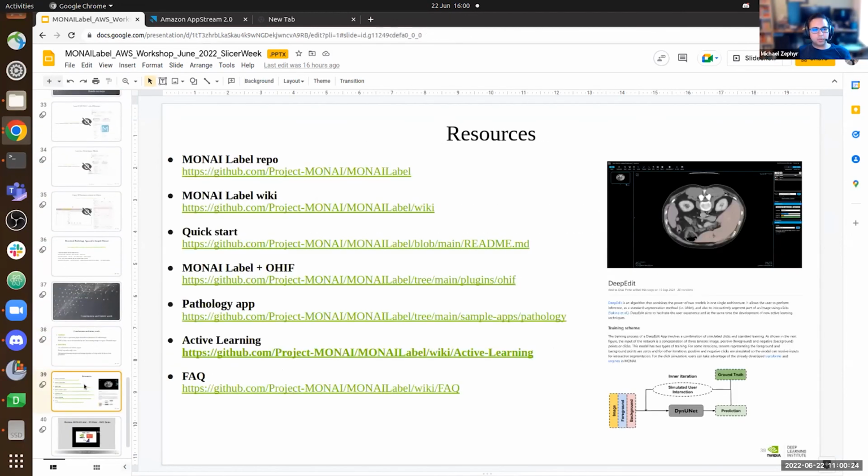Andres, we have one quick question that came in that I wanted to answer before we send people away. So Andres had asked, once someone has trained a model and wants to make it available for everyone else, what's the recommended way to do that? And so I wanted to mention a little bit about our effort at our upcoming MONAI bundle / model zoo. I'll go ahead and share my screen really quickly, but I want to make sure that people know that we're in the middle of figuring out what exactly it looks like to do this.